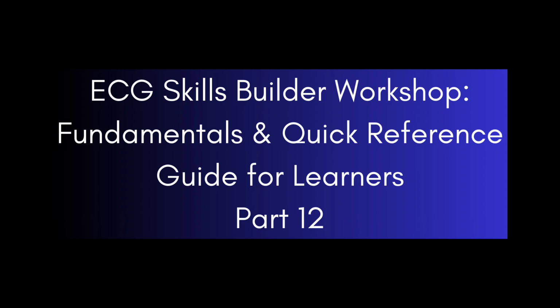Welcome back to my ECG Skills Builder Workshop, where I will be covering all of the fundamental knowledge and skills you will need to read and interpret an ECG in a quick and effective manner. This will be part 12 of my multi-part video series of doing so.